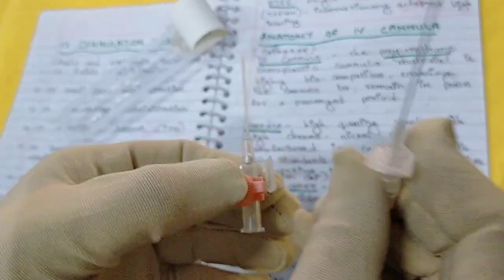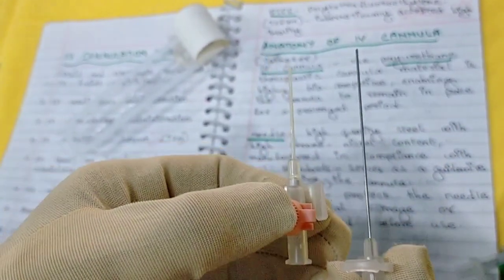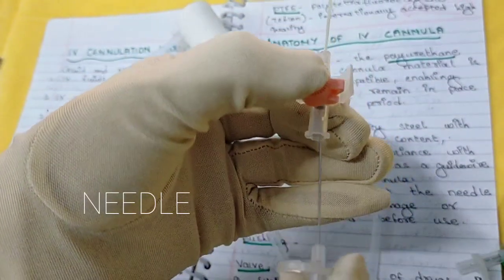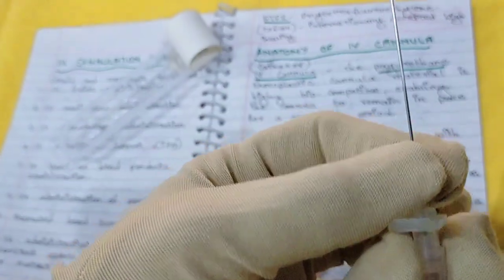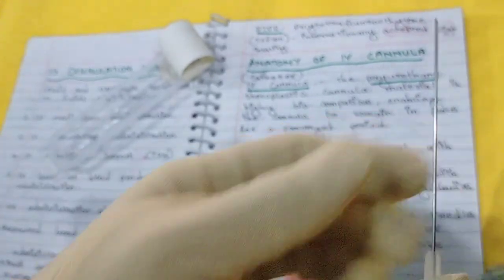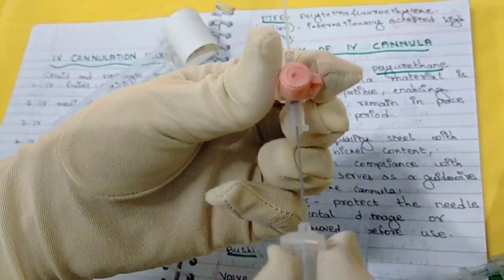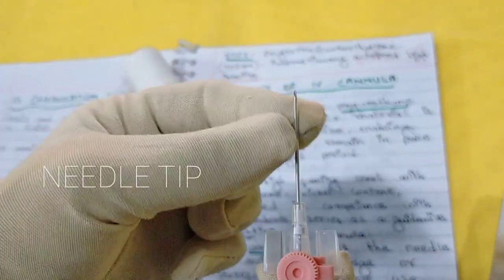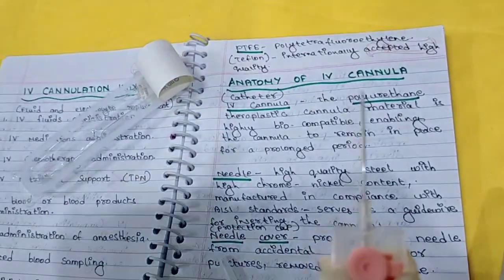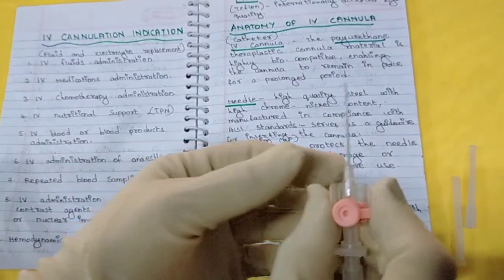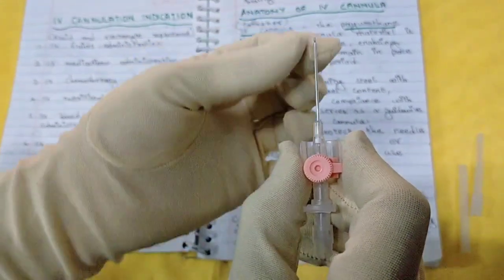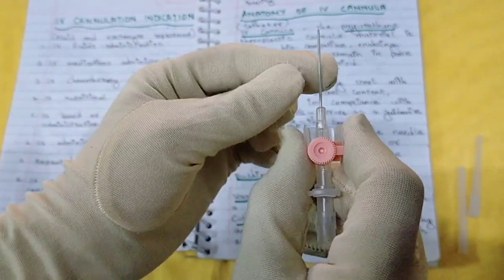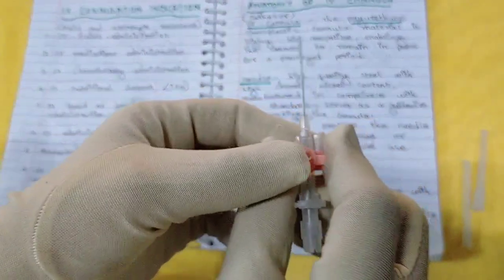Then next you have the needle. As you can see, this is the needle which is placed inside the catheter. This needle is made up of high quality steel with high chrome nickel content, manufactured according to standard. When assembled, this is the needle tip, which is triple bevel. This triple bevel tip allows effective venipuncture — it supports effective puncture when inserting into the vein.